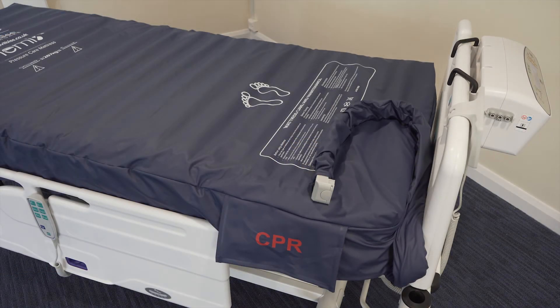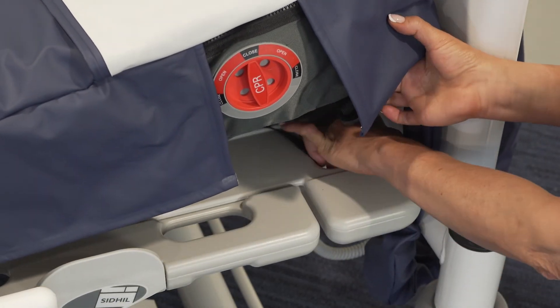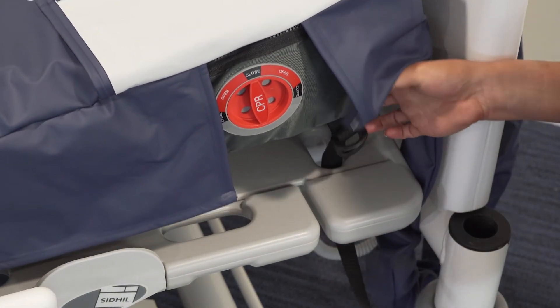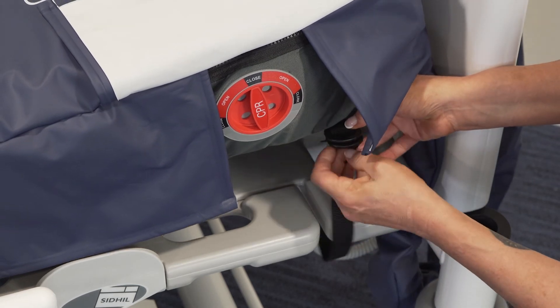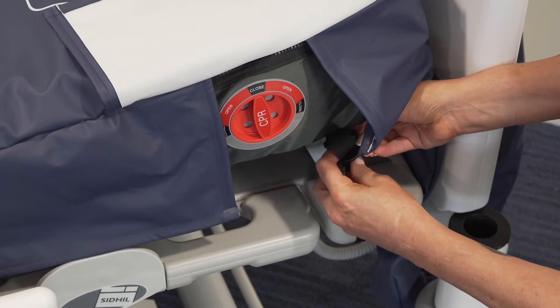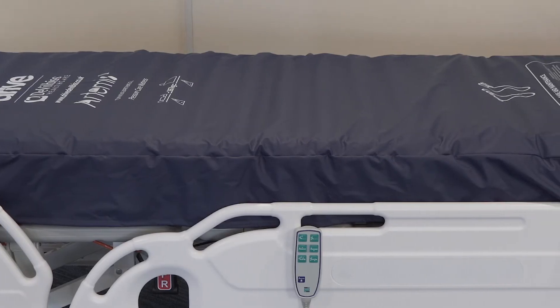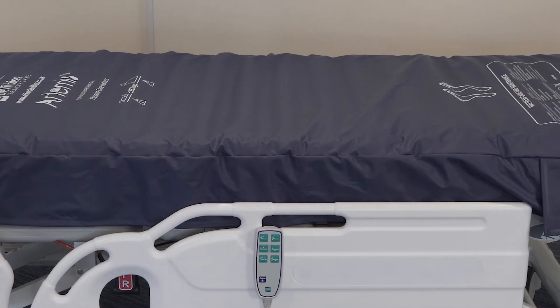Once placed on the bed platform, ensure the air connector tubing is at the foot end of the bed and the feet symbol is facing up. Ensure the straps are secured around the moveable sections of the bed frame, making sure they are not twisted in order to reduce any movement during ingress and egress. Please also refer to your own local policy. Avoid contact with any sharp objects that could puncture the mattress.